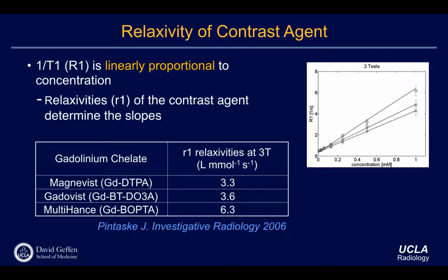Yeah, so relaxivity is basically, again, a slope, right? High relaxivity means if you change, say, 10% of the concentration, your relaxation change is higher. That means you use a little fraction of the contrast agent, and it shortens the T1 much more. Again, shorter T1 means higher signal, right? So in general, high relaxivity means your SNR will be better because T1 gets much shorter. Okay? In this context, we're not really looking at the SNR perspective. We're more looking at how to convert from signal intensity to concentration. Then we're just using a lookup table type thing. But in practice, having a high relaxivity means it's going to give you better SNR performance.